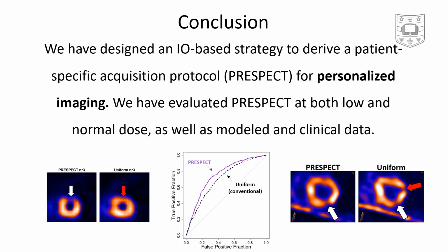In conclusion, we have designed an ideal observer-based strategy to derive patient-specific acquisition protocols for personalized imaging, which we dubbed PRESPECT. We have thus evaluated PRESPECT at both low and normal dose, as well as on modeled and clinical data.